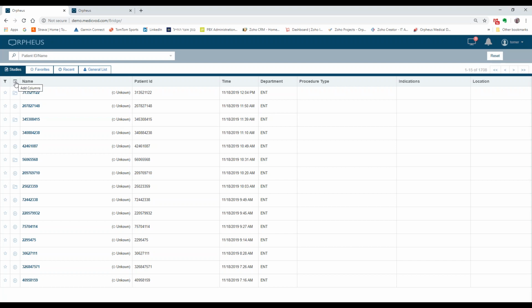Ken and Min, do you guys have anything that you would like to ask Tomer about this? Not really ask, but I just wanted to share with the group, and this may change in the future, but going into production, with Dr. Sadowski, the understanding was that the physicians will be doing the annotations all in Lumens.